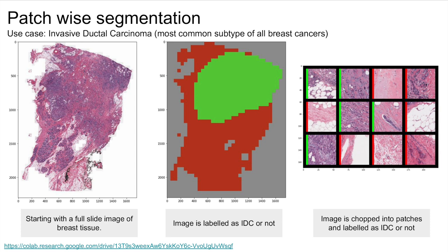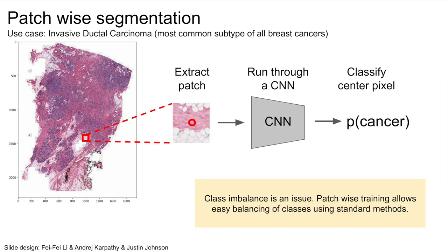The image can be segmented by hand, and then fixed resolution patches can be created and each assigned a label. Each fixed-size patch can then be extracted and used to train a model. Because all the patches are the same resolution, they can be combined into batches for faster training. Dealing with the class imbalance problem here is simple because patches can be sampled so that they are balanced in every batch. An excellent property of this approach is the resulting model can be applied efficiently to any size input using fully convolutional processing.